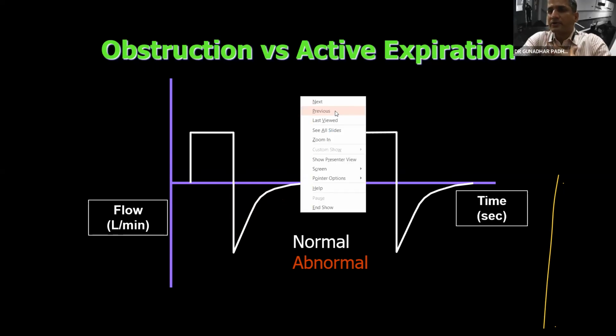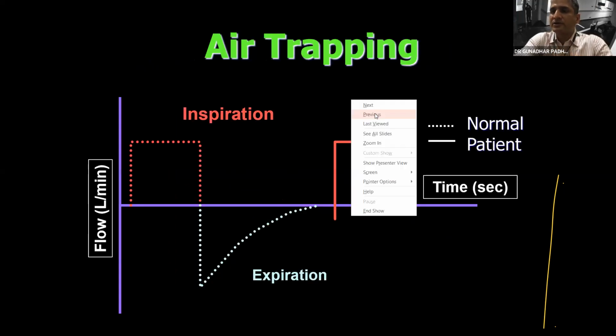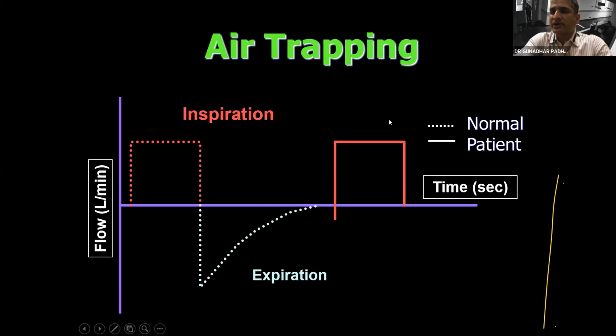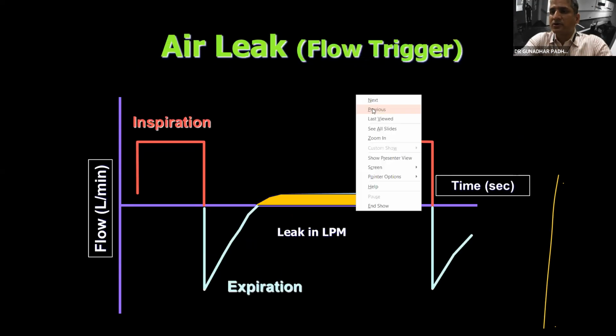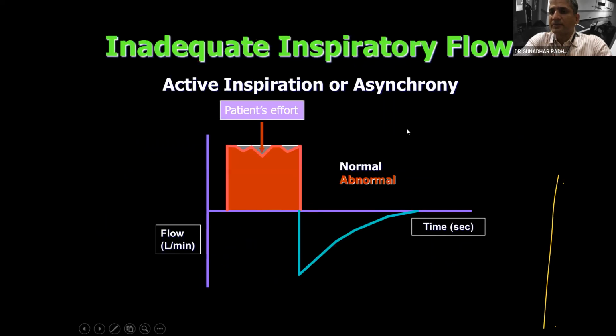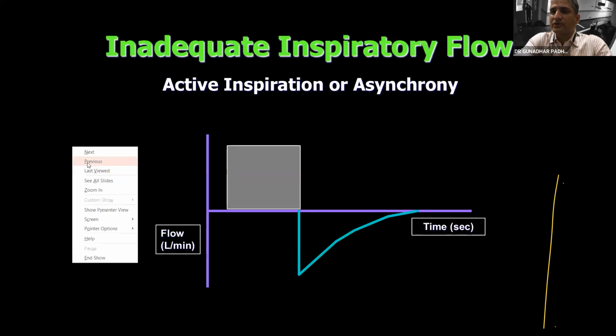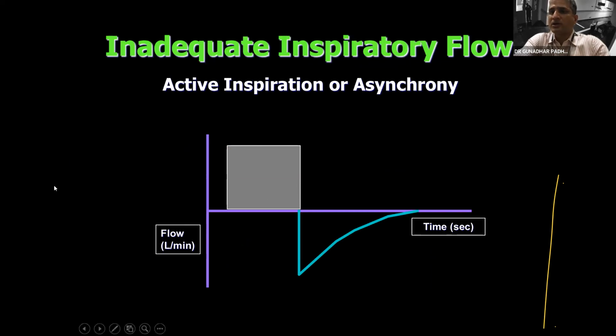For the benefit of all the exam students, basically with these ventilator graphics, you just need to identify. In the exams, they will be giving you these screenshots at your OSCE station, particularly for the DNB critical care students. You just need to identify what is the abnormality. For that, you need to understand first what the normal graph is, followed by the abnormality.